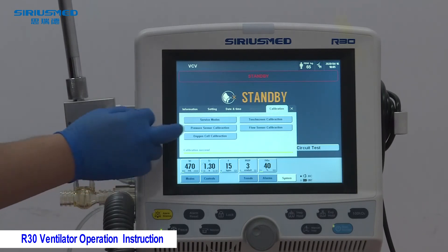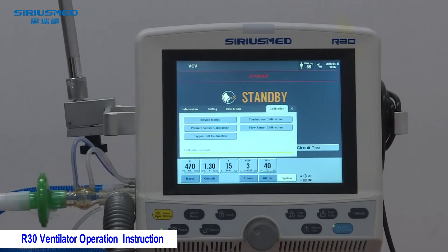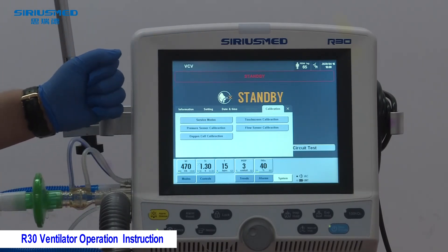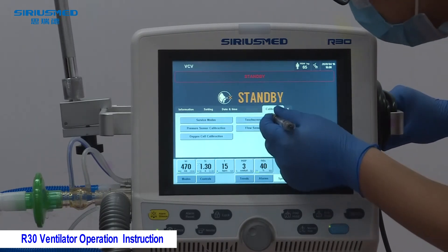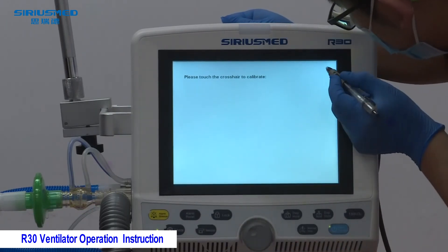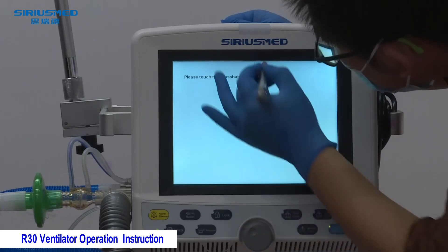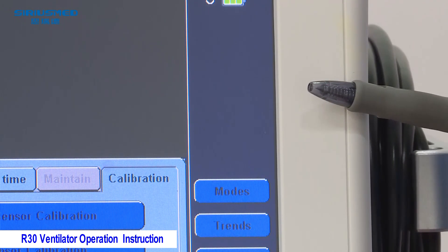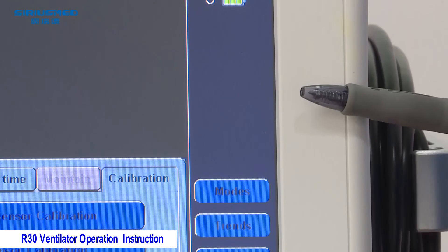To perform the oxygen sensor calibration, simply click the button and it will be done automatically. For the touch screen calibration, this is only needed when the touch screen is not working normally. Click 'Touch Screen Calibration' and follow the prompts to complete it. It is recommended to use a touch pen; if you don't have one, a regular pen without a sharp tip can also be used.